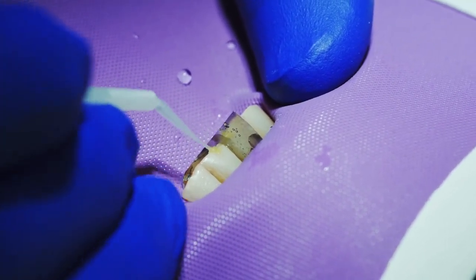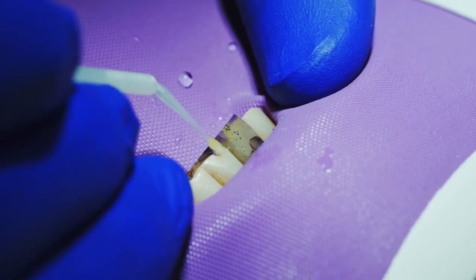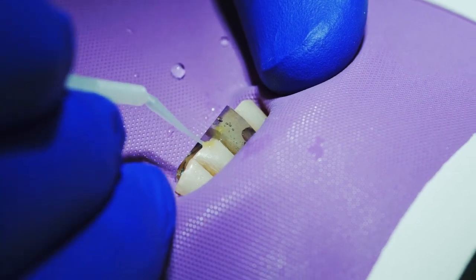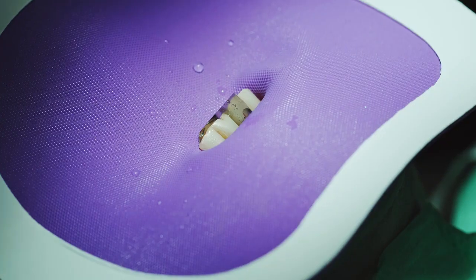This young lady's tooth has been broken multiple times, and repair attempts have been made multiple times. This is a hard place to keep a filling. We air dry it.